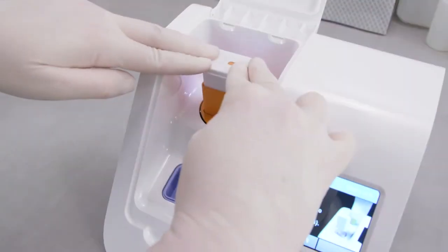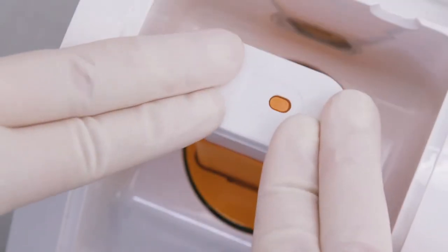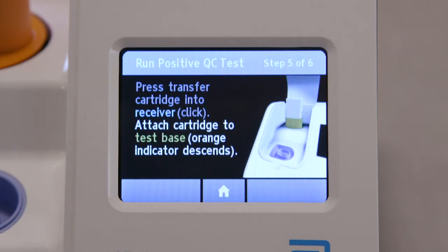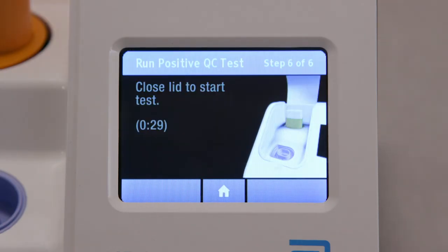If the orange indicator does not descend, continue pushing onto the test base until it does. The instrument will recognize when the transfer cartridge has been attached to the test base and will prompt you to close the lid. This screen will be displayed for up to 30 seconds once the transfer cartridge is detected. If the instrument does not detect that the lid has been closed by then, it will time out and all test pieces must be removed and discarded.